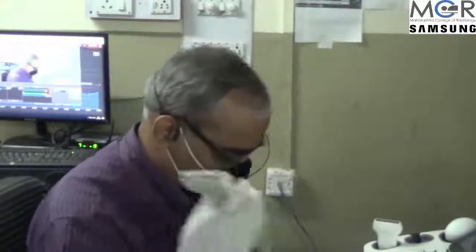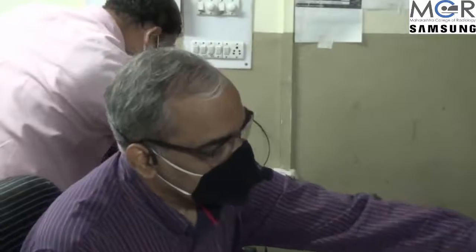Left eye since 2 months. On examination, the patient was diagnosed to be a case of anterior uveitis. So she is an old lady.